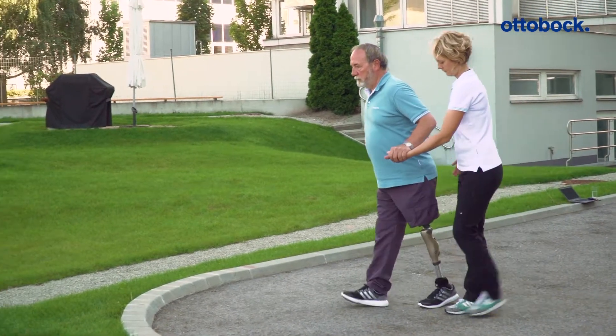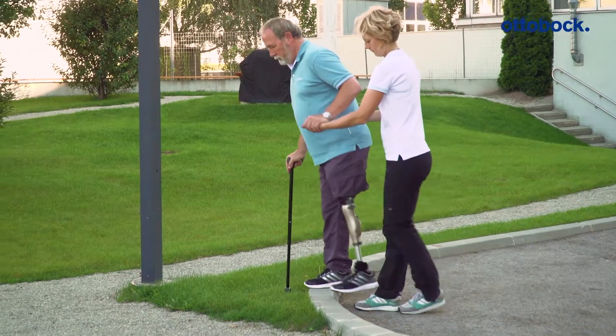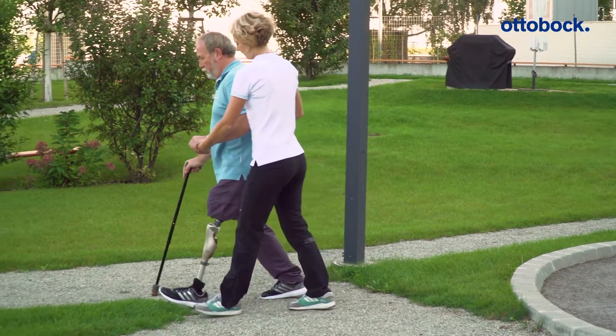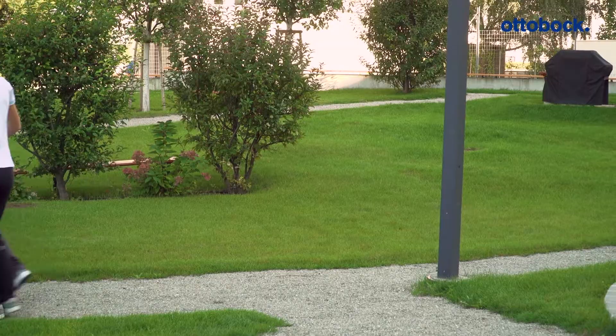The Konevo determines the threshold for stance release with each step, so it always occurs at the correct time. This is specially adapted to the gait of less mobile users and allows stance release even when using walking aids.